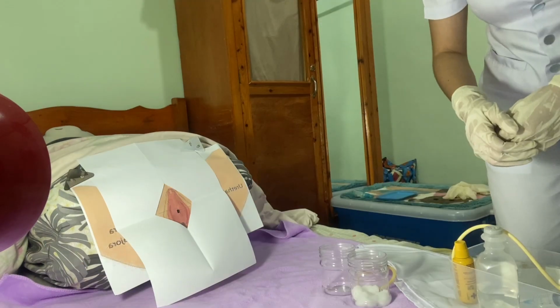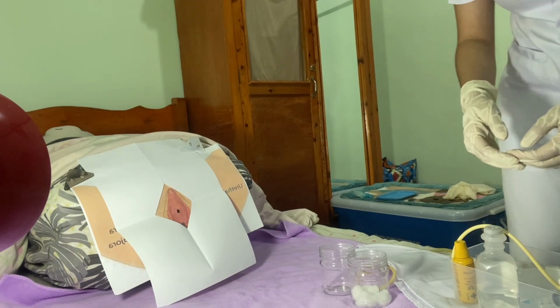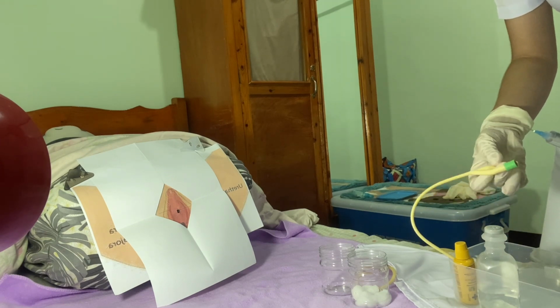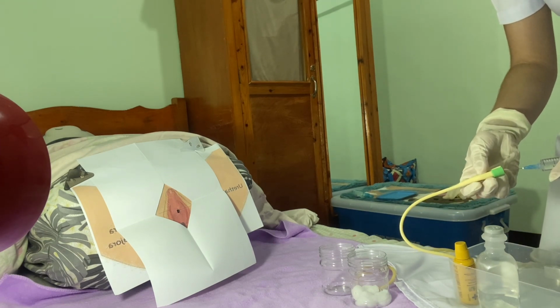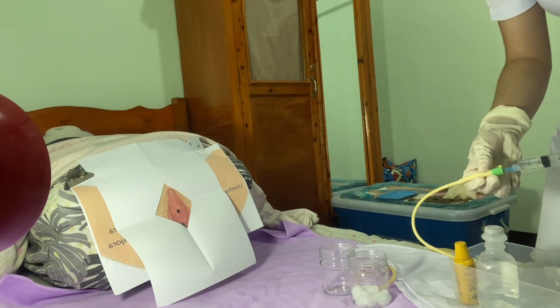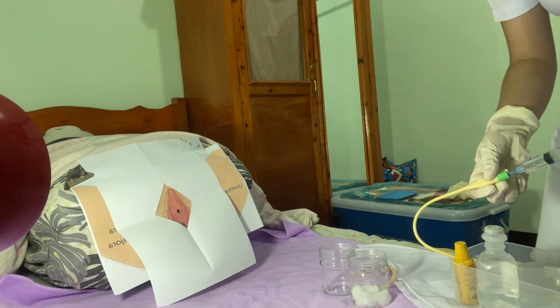Okay. So now I am going to connect the catheter with the pre-filled syringe and lubricate the catheter for about 1.5 inches. So this is done to reduce the discomfort and friction, which in turn may reduce the pain upon insertion, infection, and dilation of the urethra.